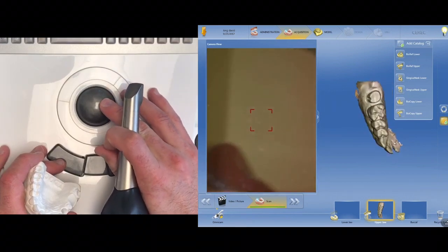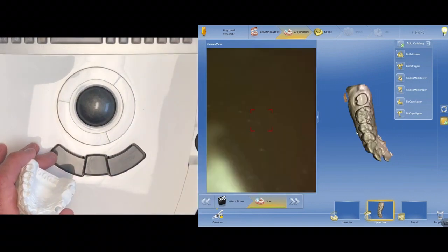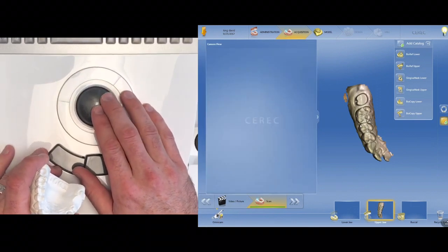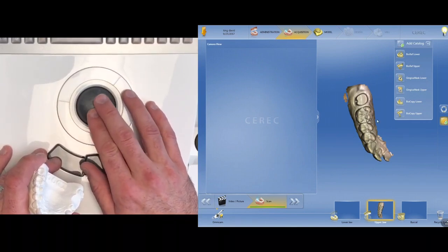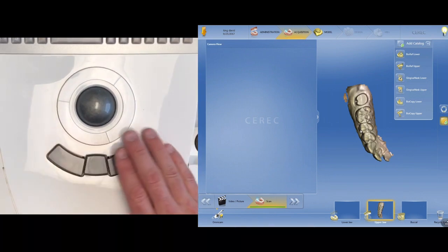And just so you know, when I'm getting started, I'm going to be looking first and foremost at the patient's mouth to get it positioned right, and then I'm going to be looking right here at the images that are coming up and then the modeling that's populating. So let's talk a little bit about these buttons and how they work.